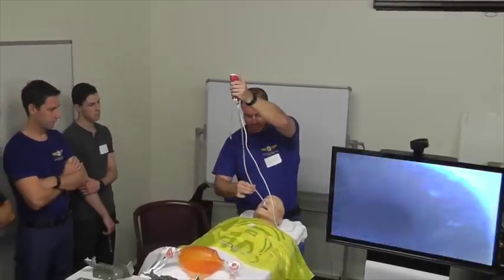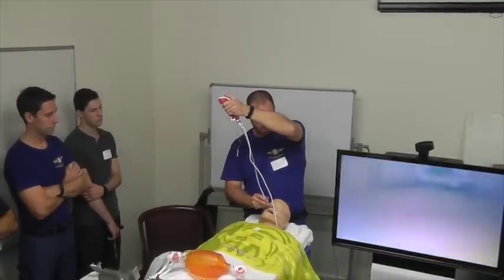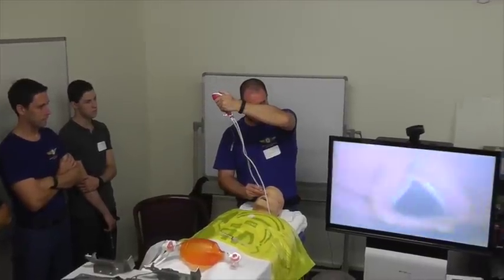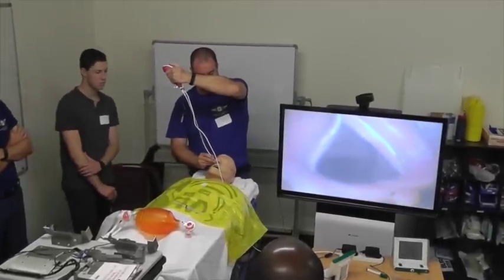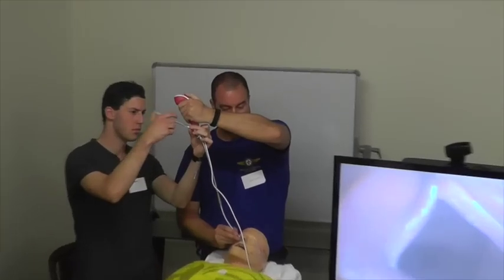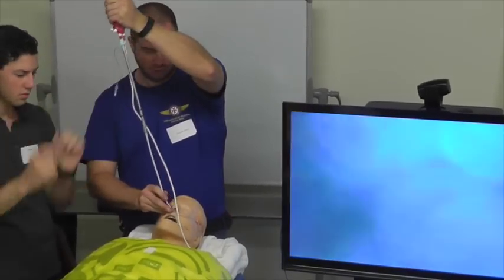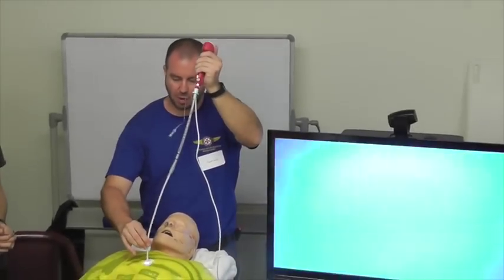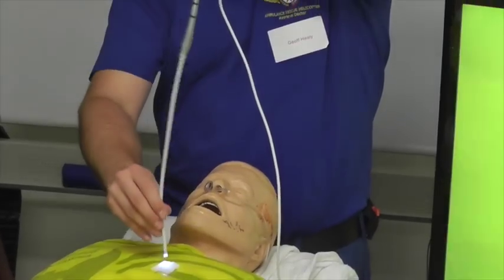We're going to place our scope through the nasopharyngeal that's split. We're going to put it into the airway. We're going to get our lovely view, keeping in the center of the screen the whole time. We're going to get our airway assistant to come up once I've got a view of the cords. If you're happy to spray some 2 ml local anaesthetic, 2%, onto those cords, you'll see it go onto the cords. It may obscure your view. If you get any secretions or anything on the end of your scope, I always put a pile of alcohol wipes on the chest, so I dab it and straight back in.